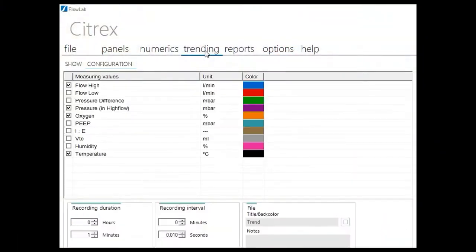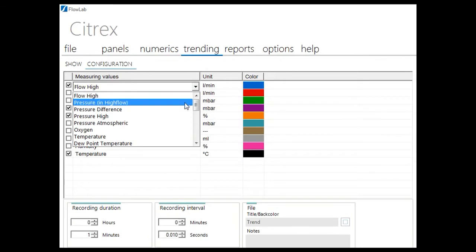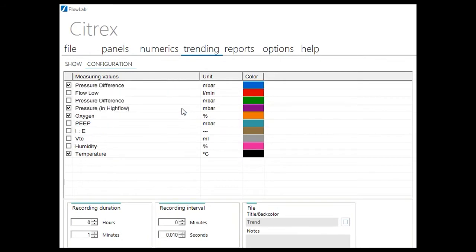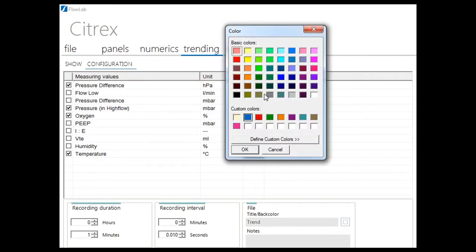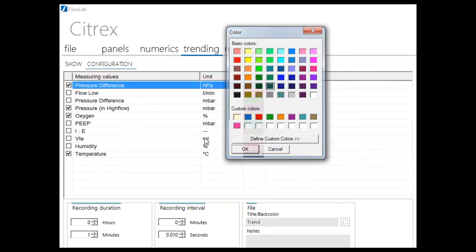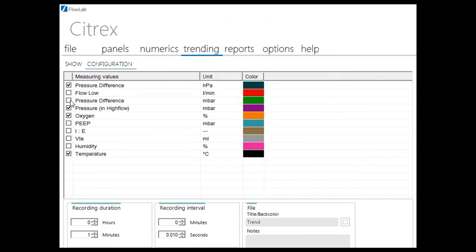FlowLab offers also trending capabilities up to 100 hours. Recording duration and interval can be defined, and ten parameters can be recorded at the same time. Trending data are stored in Excel-compatible file format.